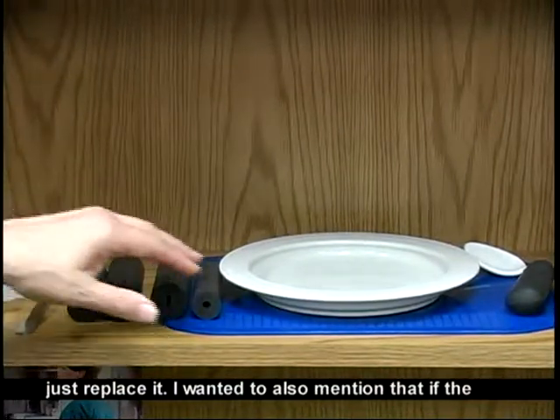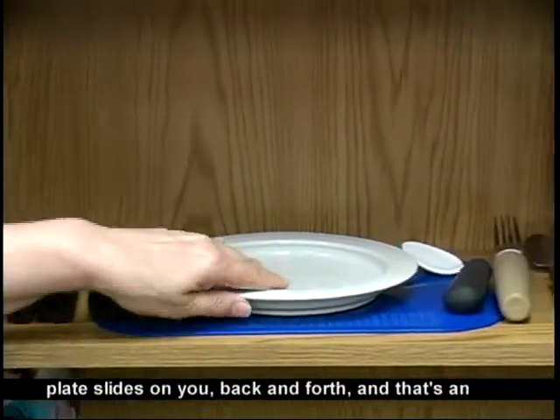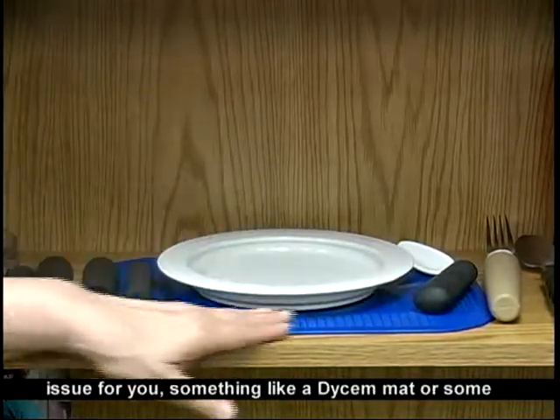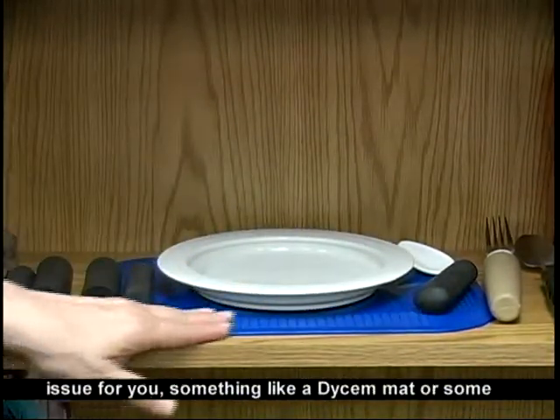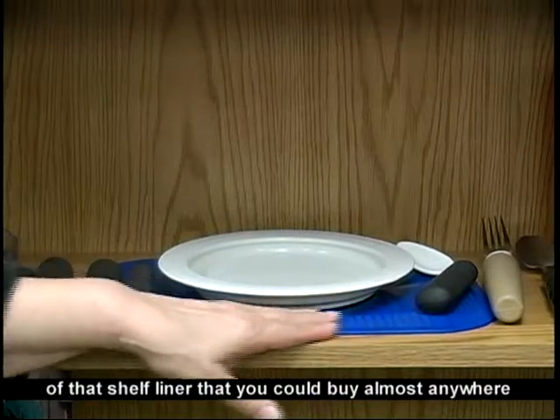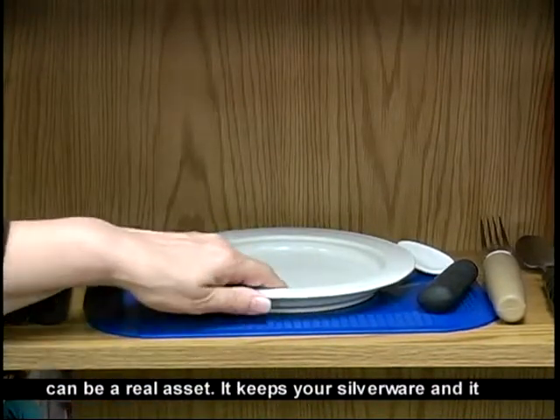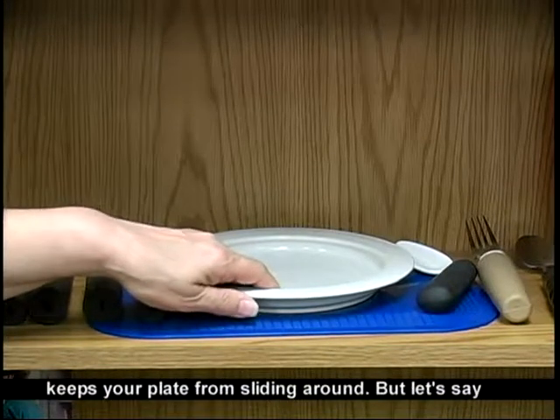I wanted to also mention that if the plate slides on you back and forth, and that's an issue for you, something like a Dycem mat or some of that shelf liner that you can buy almost anywhere can be a real asset. It keeps your silverware and it keeps your plate from sliding around.